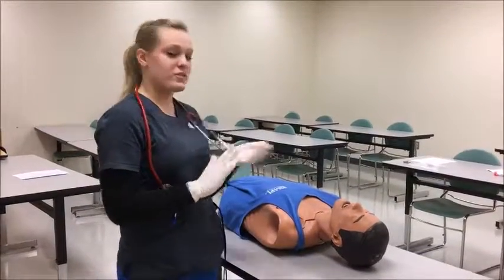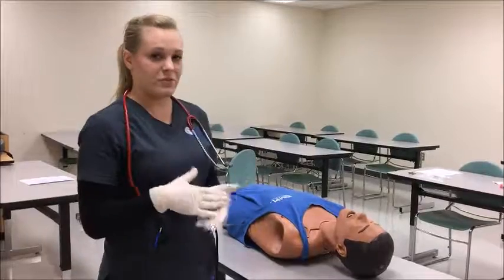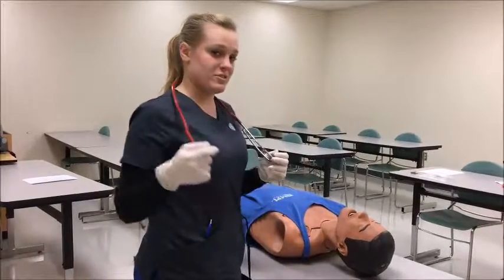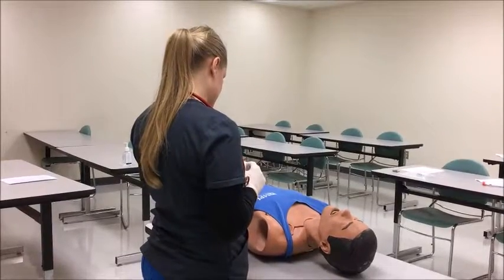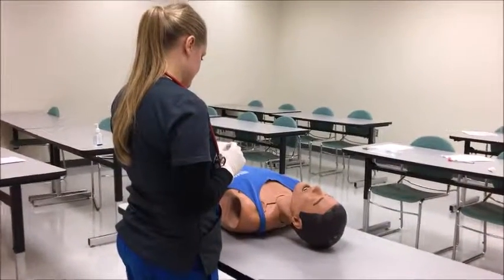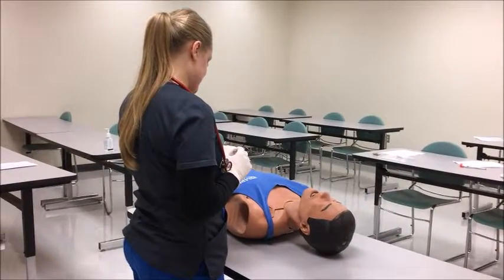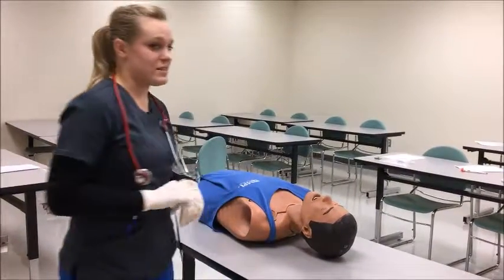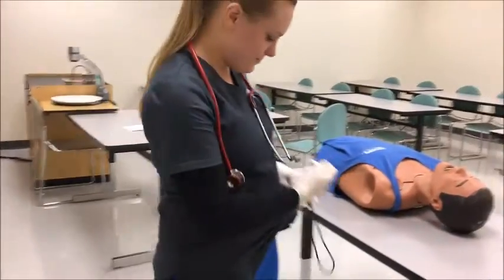And next would be your respiratory rate, and for the purpose of this video, I'm telling that I'll be assessing his respiratory rate, but in real life you would not tell the patient because they could change their respiratory rate. So you would also measure this for a full minute. Respiratory rate is 18. And next would be taking his sats with the pulse oximeter.